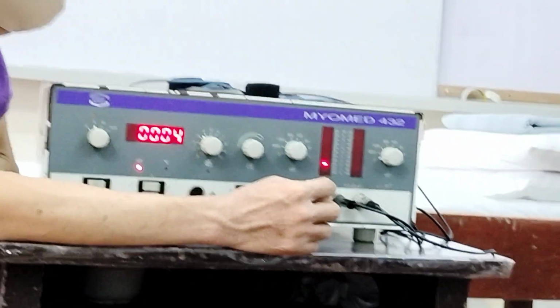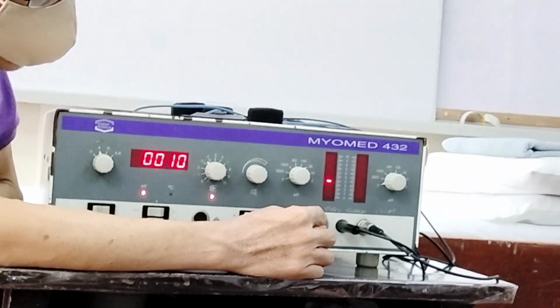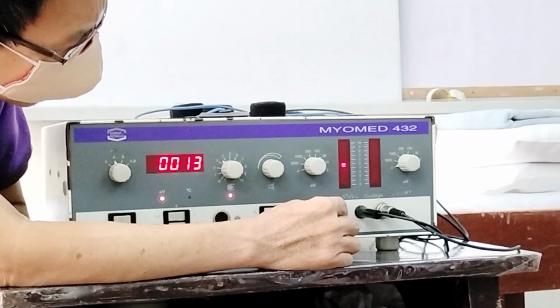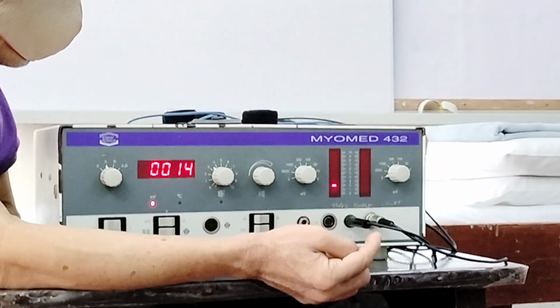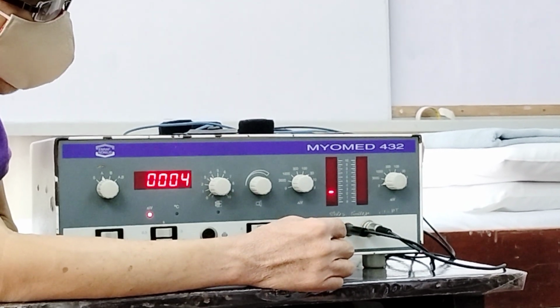Sige sir, bend it. Maka-observe naman kayo. Sige sir, bend. Sige pa yun, sir. 3 pa, sir. Sige, sir. Relax na, sir. So, kayahan niyo na ito, sir. Go pa to further beyond 3. Okay?